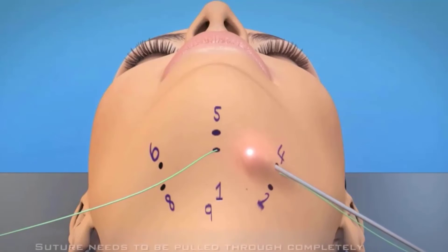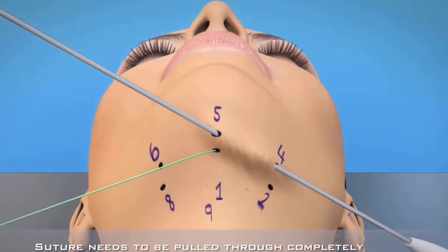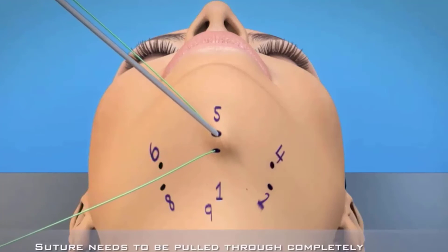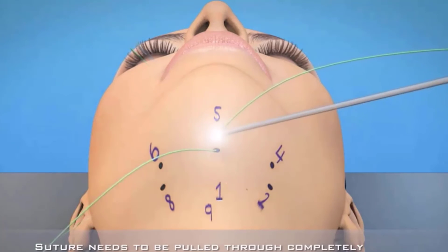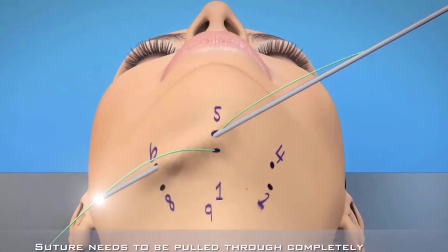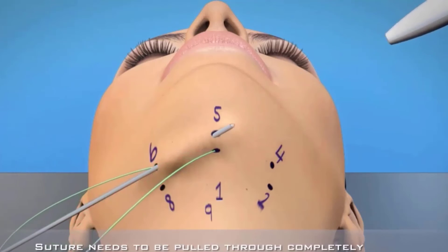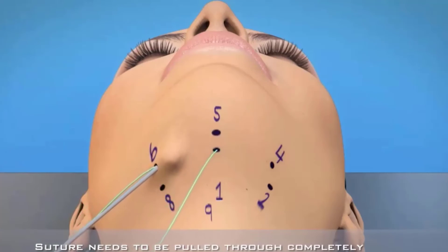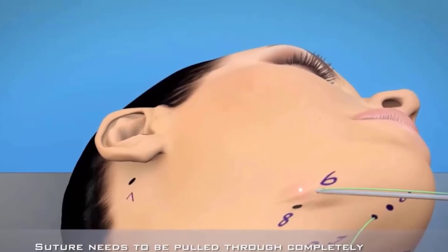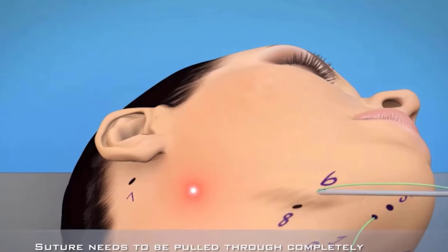This sequence is carried out throughout the entire sequencing from point 1 to point 9, until the suture swings back around the right ear and then exits through point number 1 or point number 9, which is the same insertion site. It is important to pull the suture out to length, so that the suture only has approximately 6 inches exiting from the initial insertion site. If one does not advance the suture throughout the placement of the sequence, the suture, because of its braided nature, may lock into place, and therefore it will not allow the surgeon to utilize the complete length of the 100-inch suture segment attached to the suture rod.